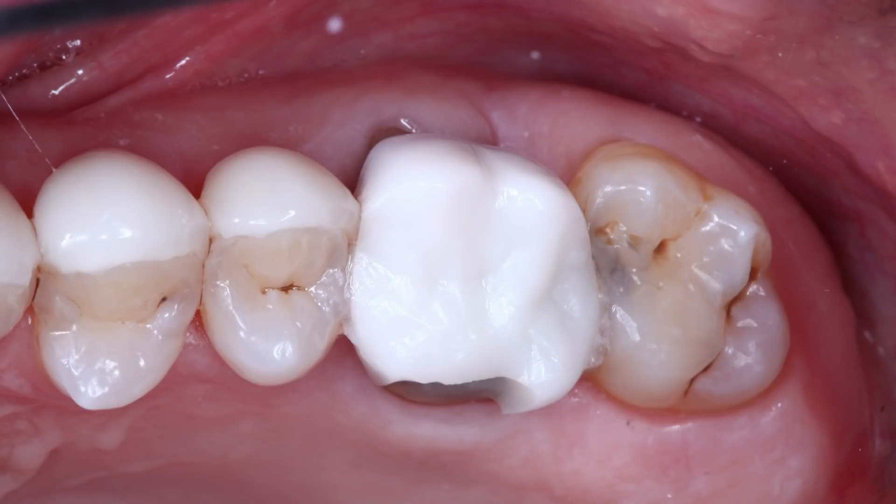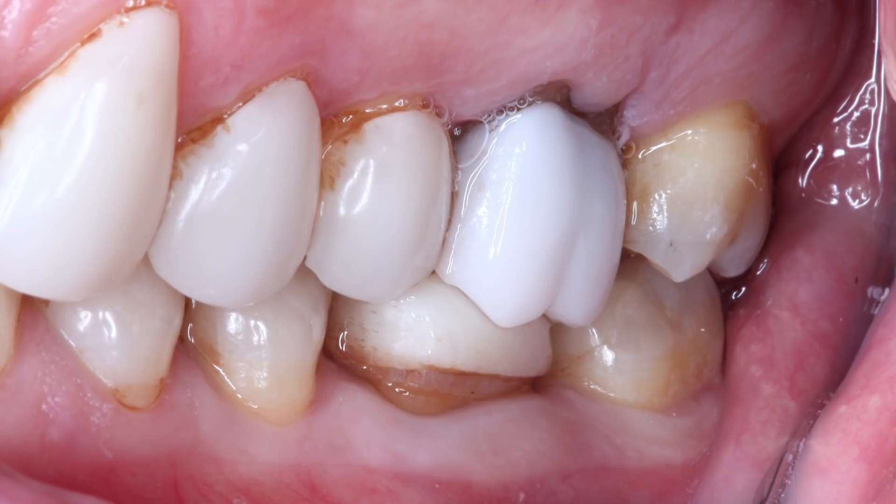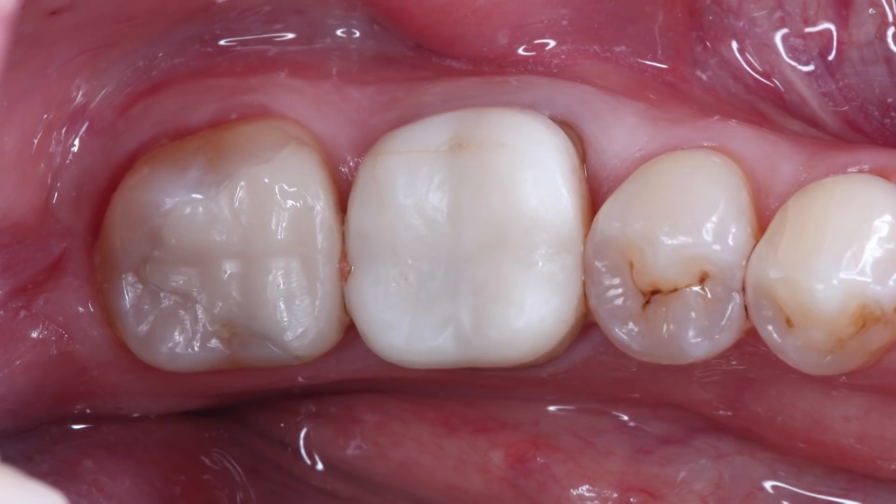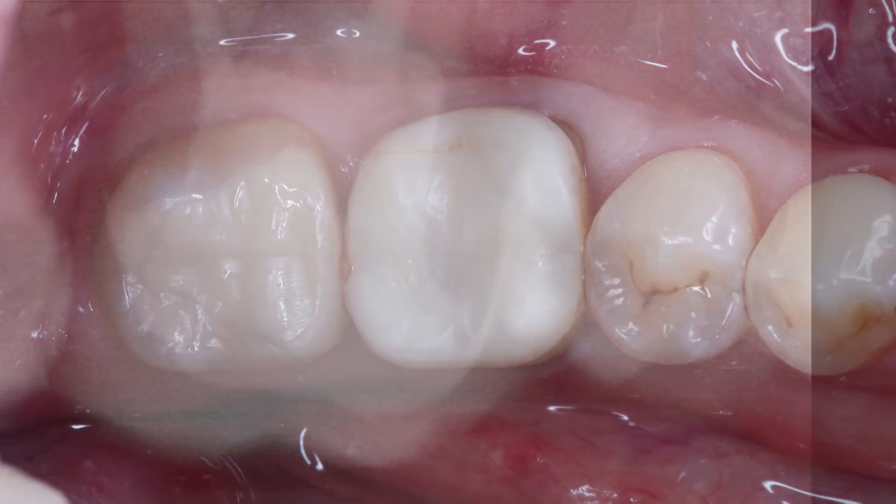We have a 50-year-old male that presents with a fractured Emax crown on his upper left first molar, number 14, that also appears to have super-erupted, most likely from the low occlusal position of the crown on the lower left first molar, number 19. We plan to replace both with Bruxer Now crowns milled chairside using the Glidewell in-office solution. The upper left second molar also has a large cavity on the mesial, so we'll work on that while the crowns are milling.